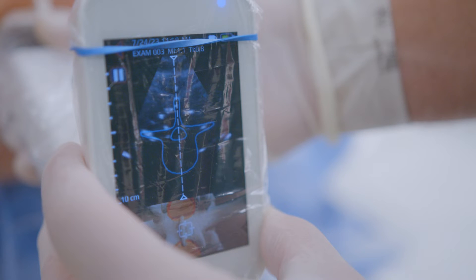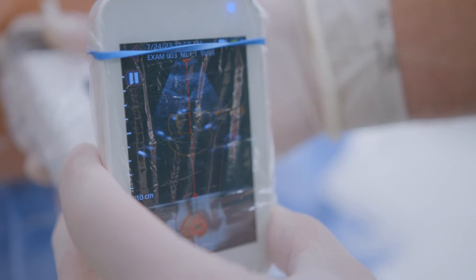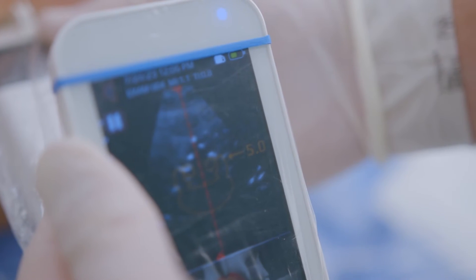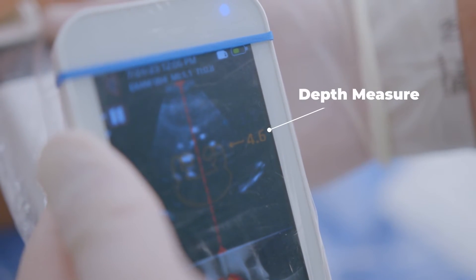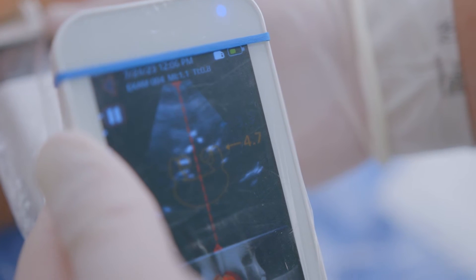Notice the blue overlay, which represents the spinous process. Scan slowly vertically to identify the interlaminar space. When the orange overlay is displayed, you have found the interlaminar space. Please note that pressure while scanning can compress tissue and cause the depth measurements to be underestimated. For more accurate depth measures, release pressure against the skin prior to noting the depth measure.